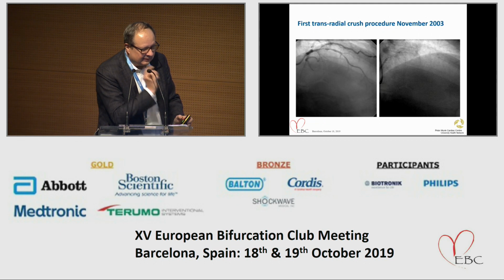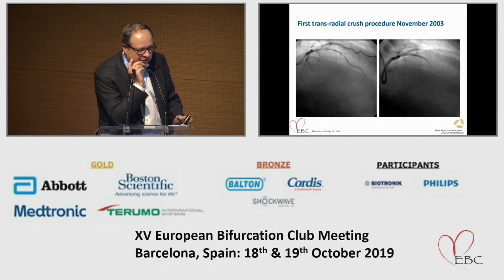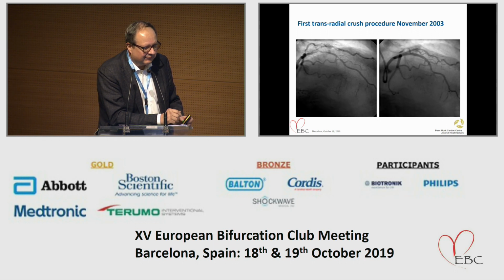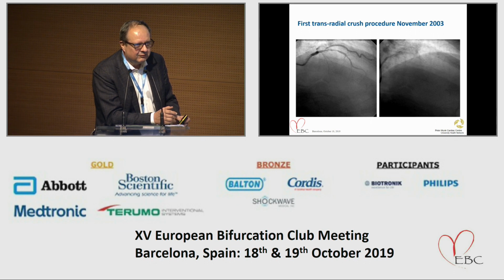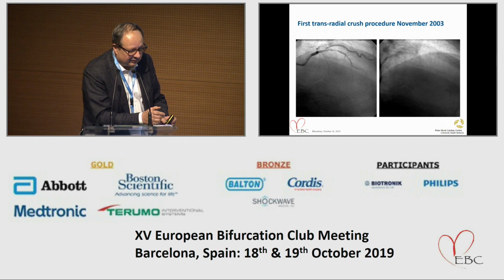And by November 2003, after that publication, the light went on, and this was the first time with drug-eluting stents, with Cypher, that we could have a 2-stent procedure to work on complex bifurcation lesions, which, of course, prior 2-stent techniques done in the bare metal stent era, Culotte was associated with 80% stent failure or procedural failure rates at medium intermediate term.